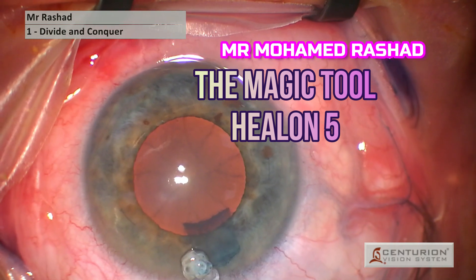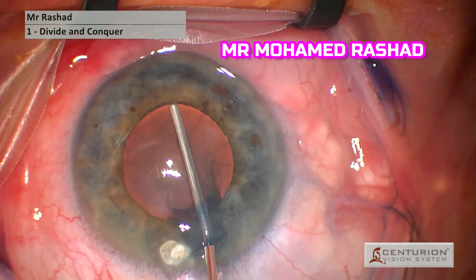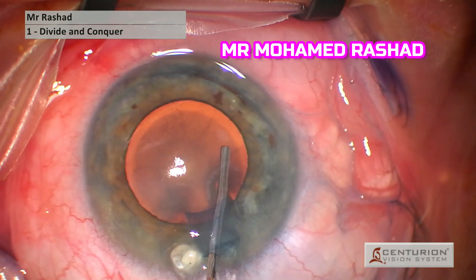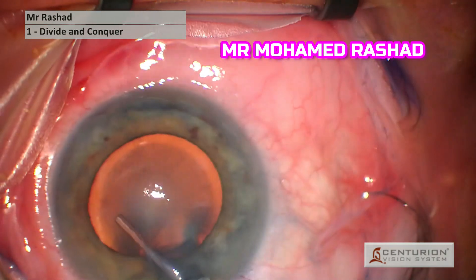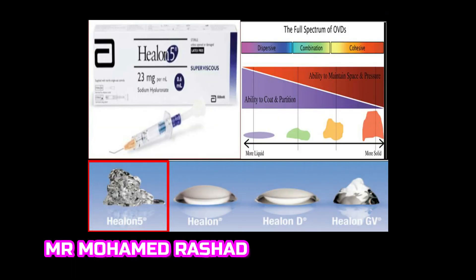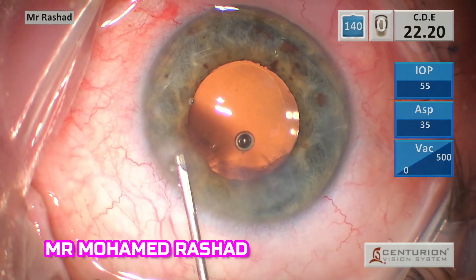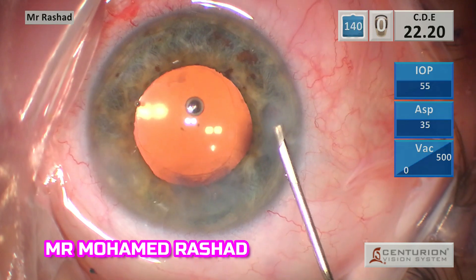Then comes the magic tool, which is Healon 5 in this case, which is more viscous than Healon GV. You can see how it dilates the pupil and maintains the anterior chamber throughout the phacoemulsification operation. It is viscoadaptive as well, so it protects the cornea in cases of shallow anterior chamber. We hydrate the wound — this is the end of the case, same steps as before.